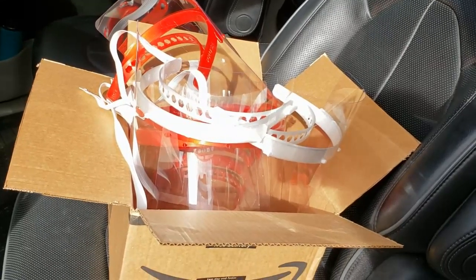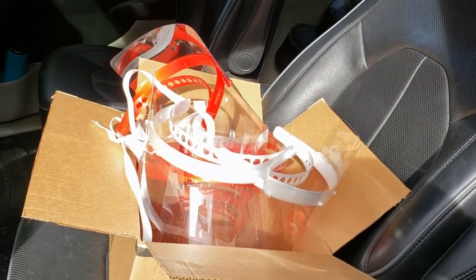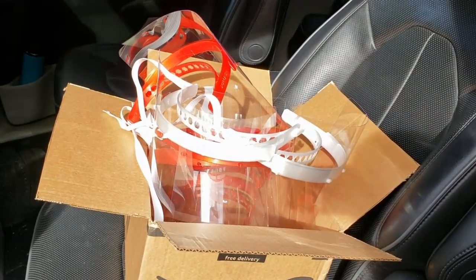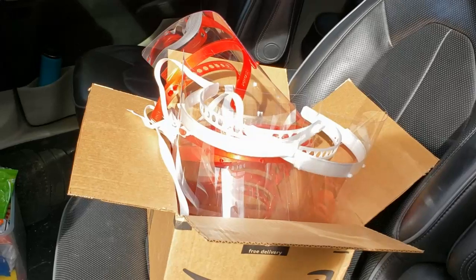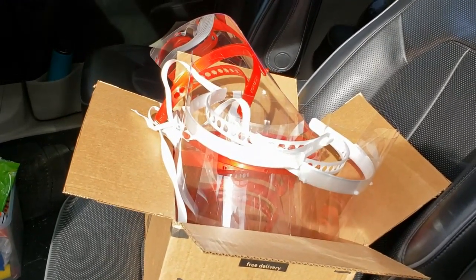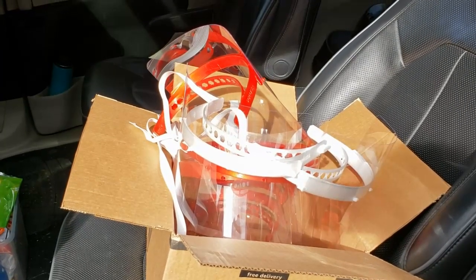We 3D printed 10 face shields. I want to give a big thank you to my company Thor Labs for supplying the actual polycarbonate shields — they had those cut out and printed. So we're on our way to drop these off at the hospital, and then we're going to make some more and hopefully do this again next week.